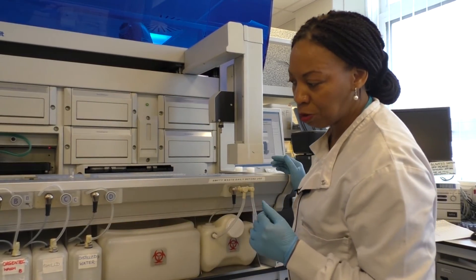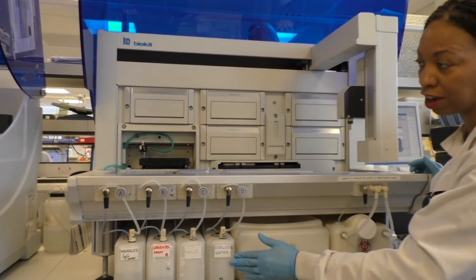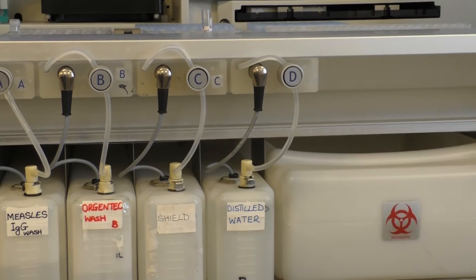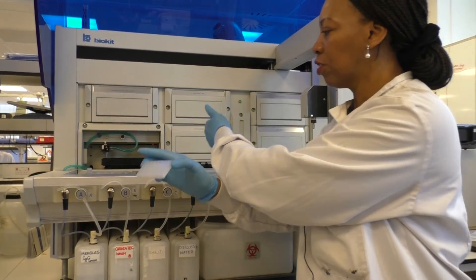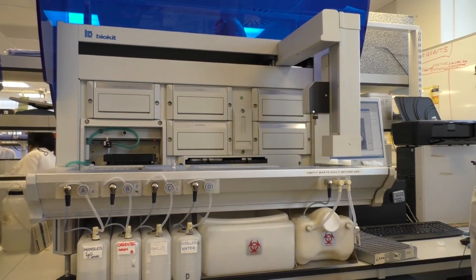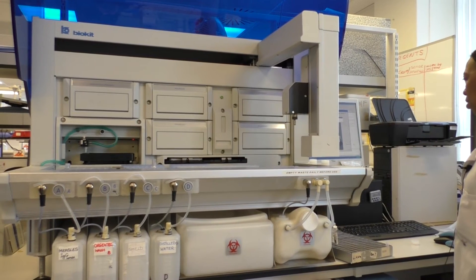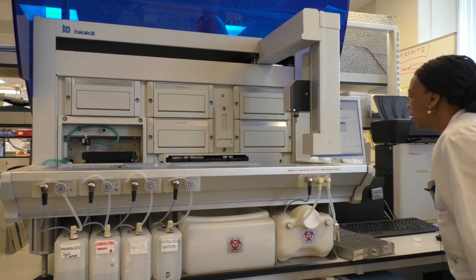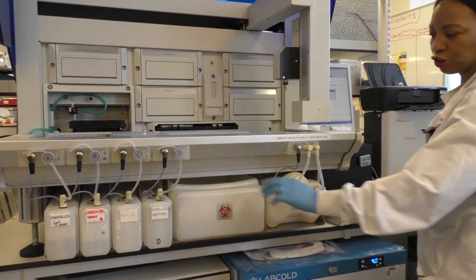Next, the machine checks whether we have enough wash buffer, so wash buffer is added, and then whether we've got enough deionized water. It then asks us to check that we've loaded enough strips — within these strips the machine takes up the patient serum and does the dilution. Then it checks whether we've got enough tips on board, which we have.